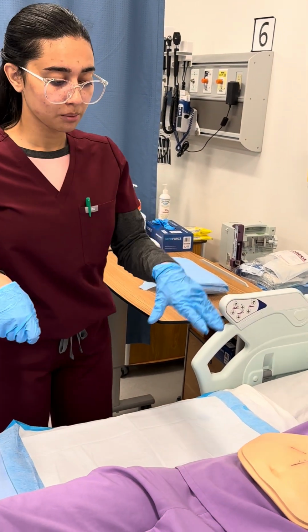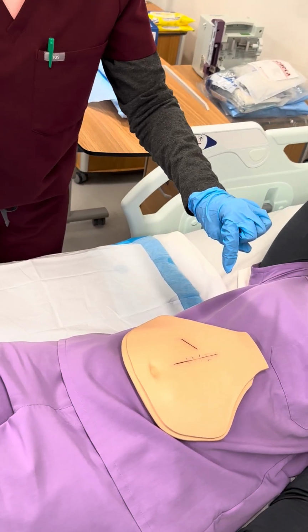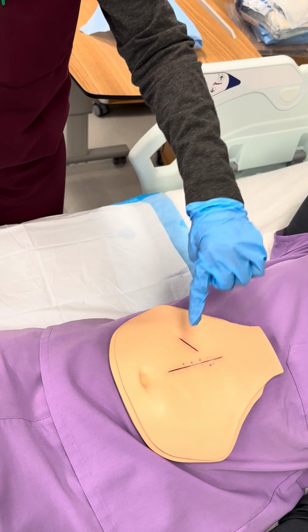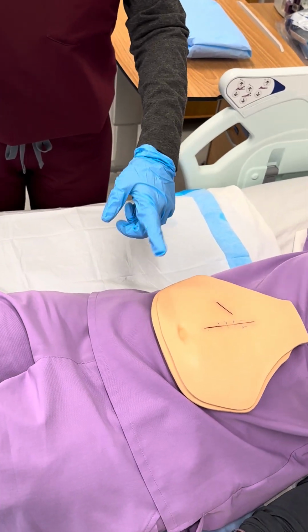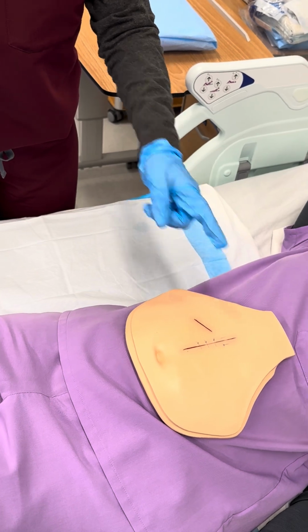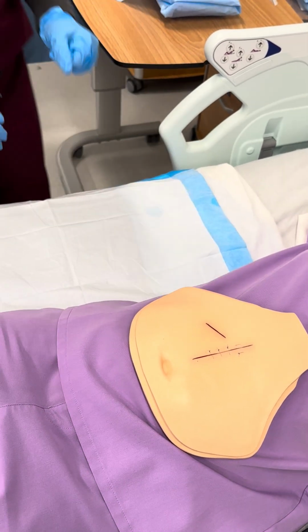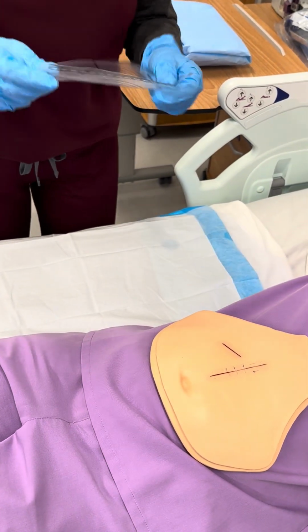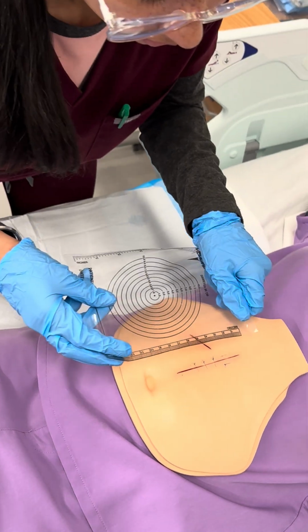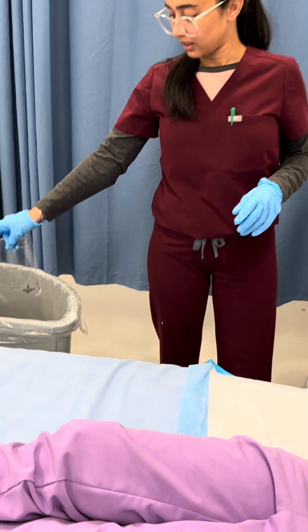So talking about the wound, first of all I will only pretend that it is just a single wound here. This wound is not present here. So the location of the wound is in the upper quadrant of the abdomen, 1 inch above the umbilicus midline. And to check the length of the wound, I'm going to use this scale, and I'm not going to touch it with the skin. So the length of the wound is approximately 7 centimeters.